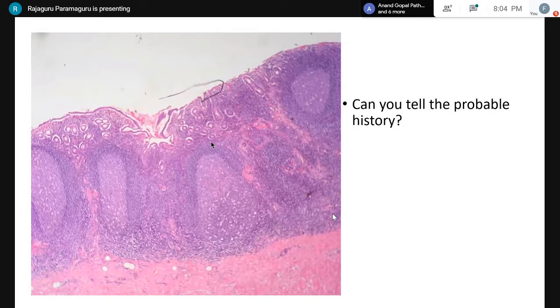A patient who has undergone colostomy, and the part of the redundant bowel, the pouch, from which there might be blood and mucus. So a biopsy might be performed to rule out inflammatory bowel disease. So the diverted area, the pouch, might show these kinds of changes with the reactive lymphoid aggregates in the base, and some architectural changes of the crypts.